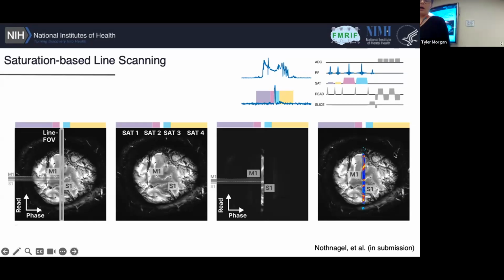It is up to the user, but at the same time, I would say the field is kind of latched on to a standard of about 3 millimeters. So you don't get much specificity along the cortex. Our aim is really to kind of leave that be, but try to go for high resolution through the cortex. But yeah, that's an area of separation.